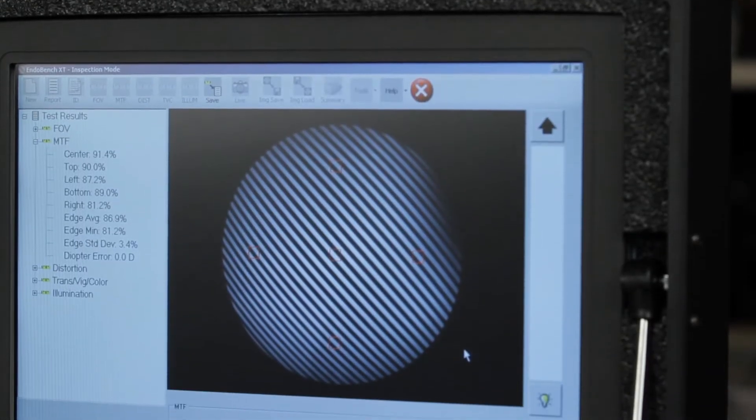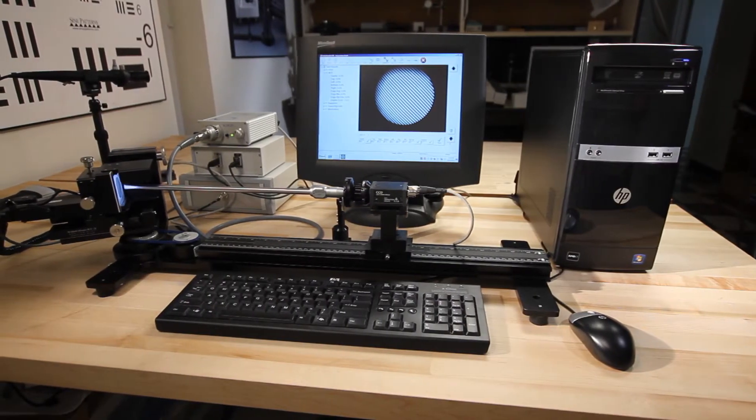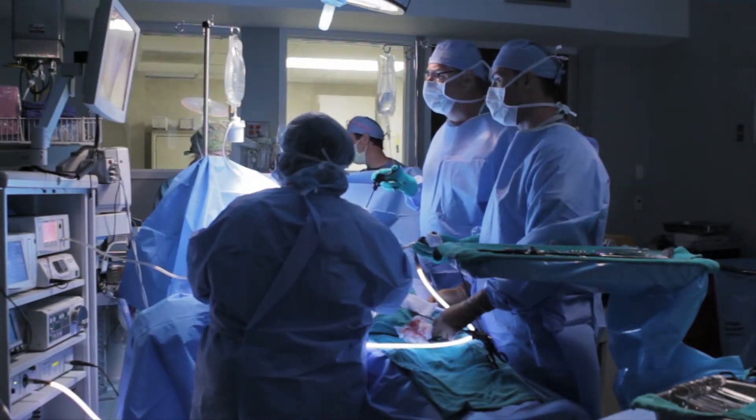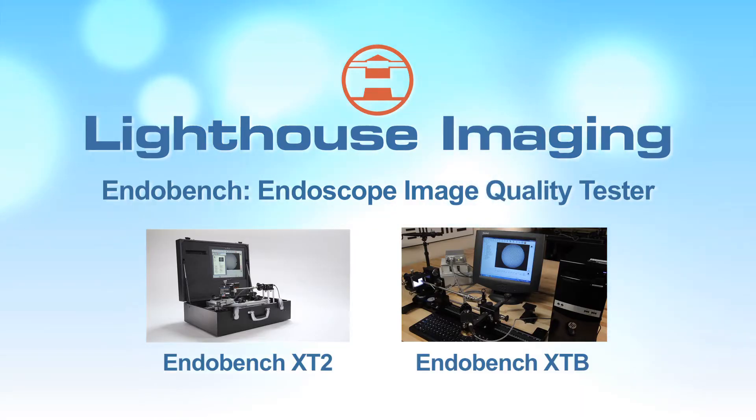Verify endoscope image quality before and after repair. Ensure patient safety and save money. The EndoBench series of testing instruments from Lighthouse Imaging.